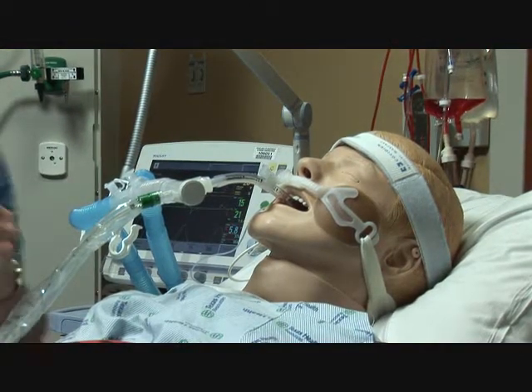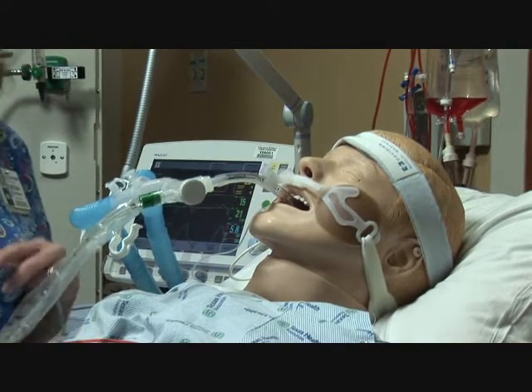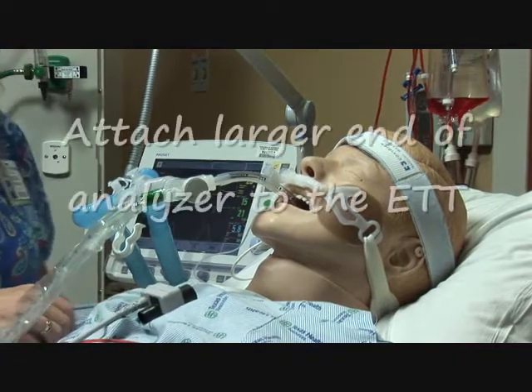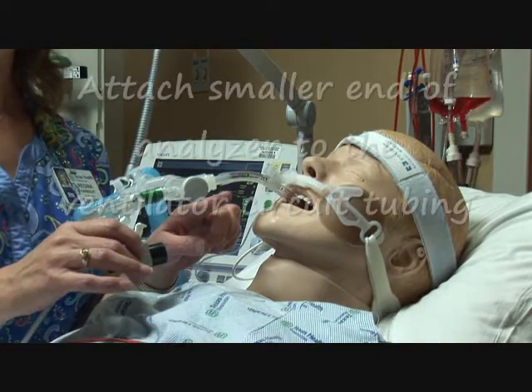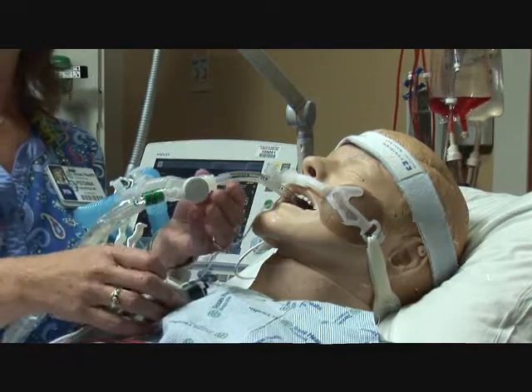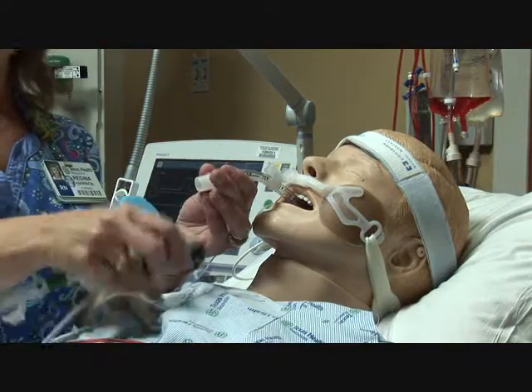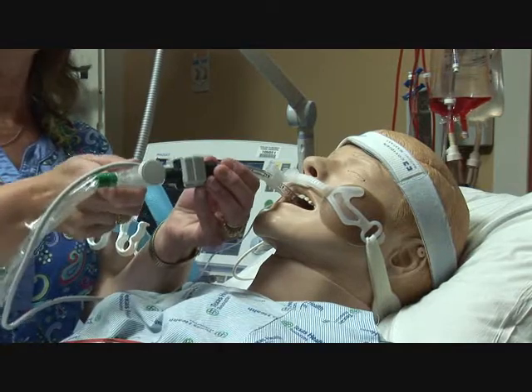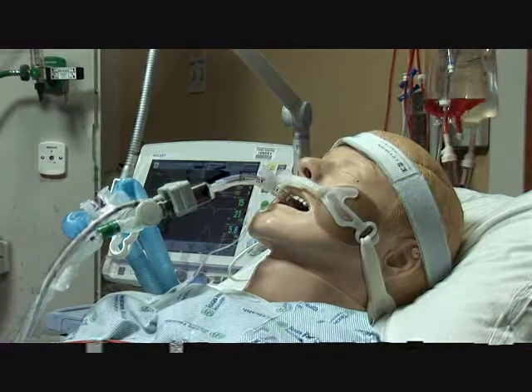And now we're going to attach the analyzer to the ET tube and ventilator. And you want to make sure that you have it all ready to go so we don't lose any ventilation. You would attach the larger tube to the ET tube and the smaller tube to the circuits. So you want to hold on to the ET tube for security and detach and then hook the larger tube up and then the smaller tube to the circuit. And then you're ready to analyze.